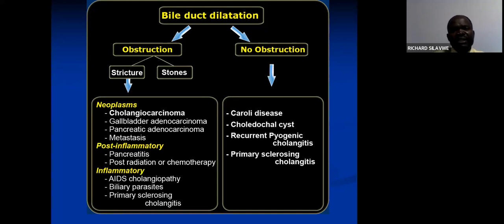When there is a stricture or stones, these are things you can suspect to have caused the dilatation. There are times when they are dilated without obstruction.